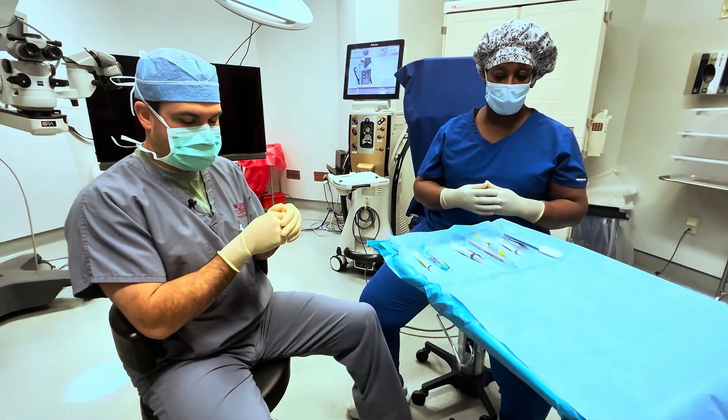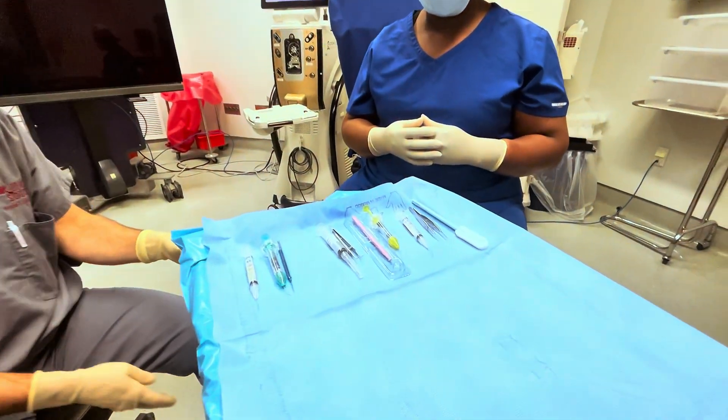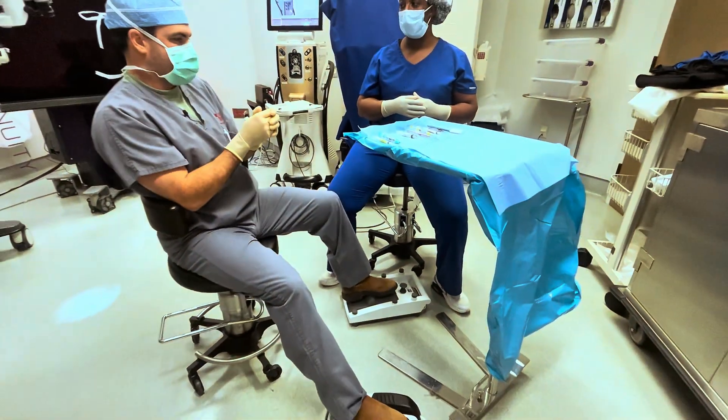We're going to demo how to pass sharps safely. I put my microscope pedal between the V — now I've got good spacing and I feel like I'm in a good position.